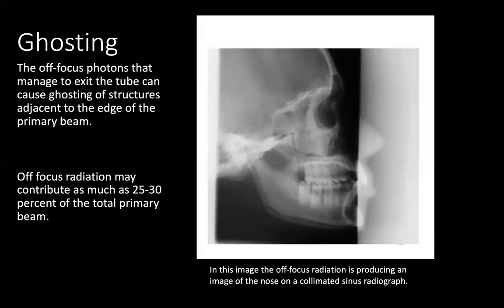In the image you see here, the off-focus radiation is producing an image of the nose on a collimated sinus radiograph.